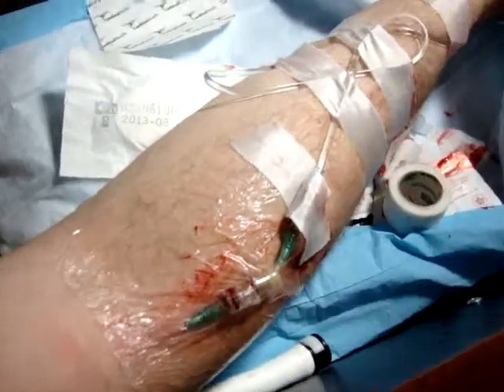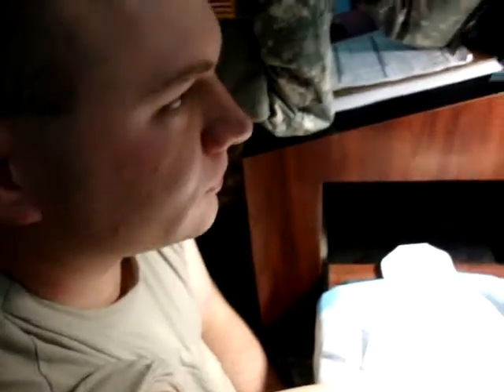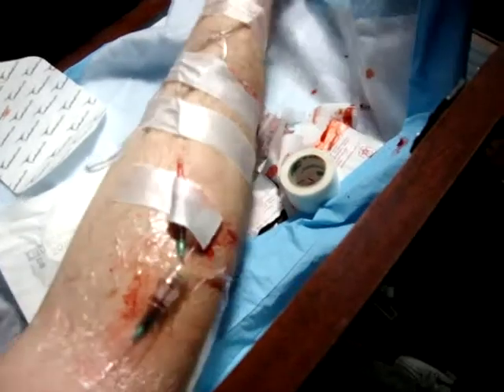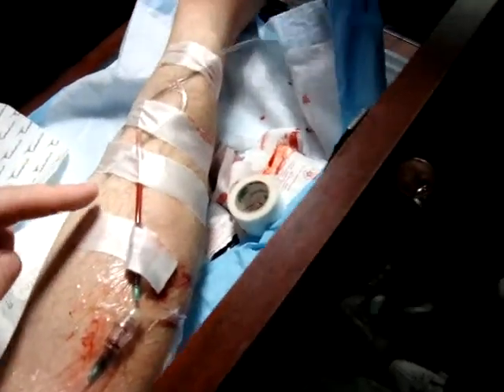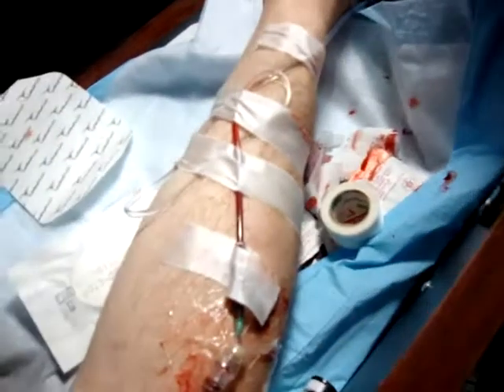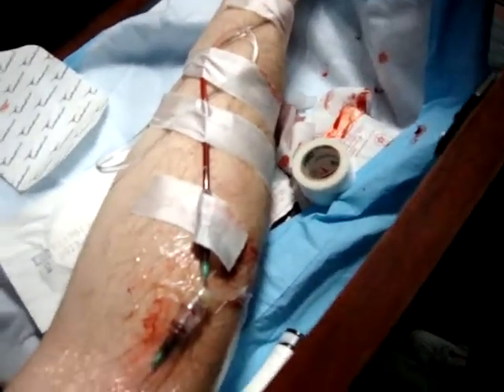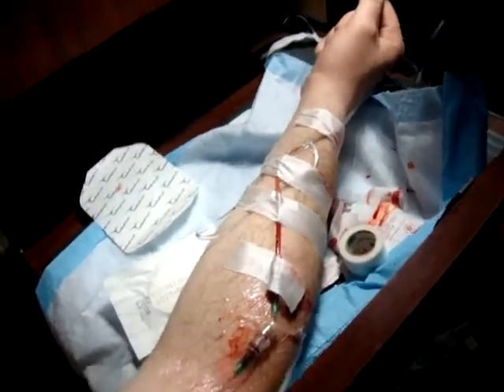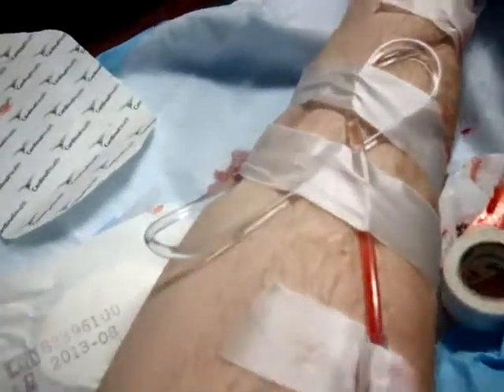Are there any questions? The significance of doing that is: if you are on the go or you have to run and you get snagged on it or cut off on it — see? Nothing. It did not come out. Oh my arm — there is blood coming out. Now it works. You see blood coming out because it is below his heart. Put it back up — look at that, and it goes back in. That is spiffy.